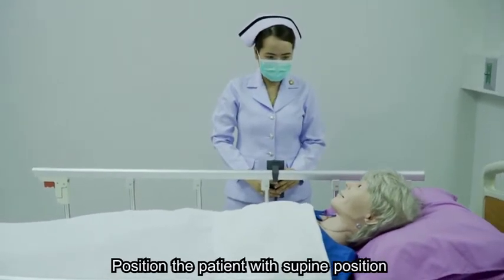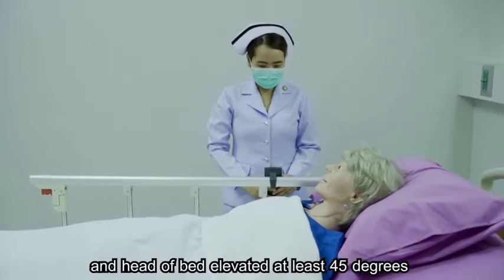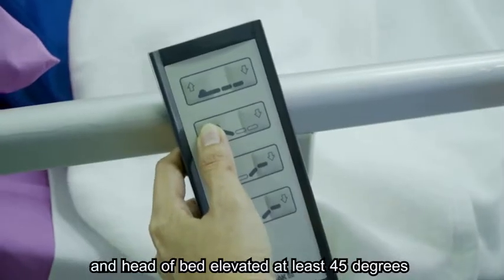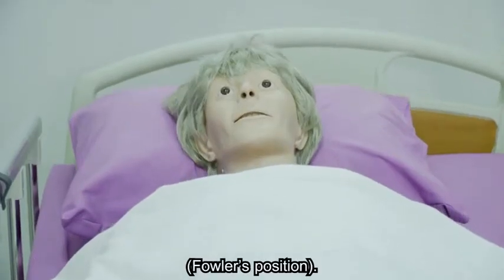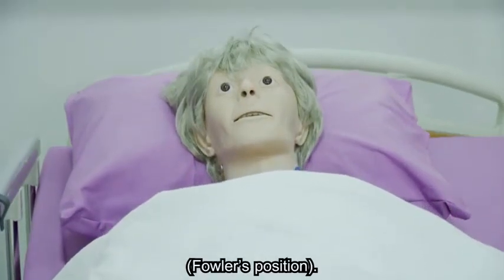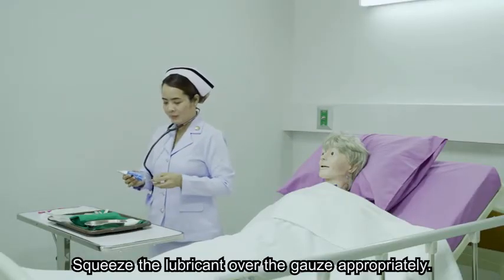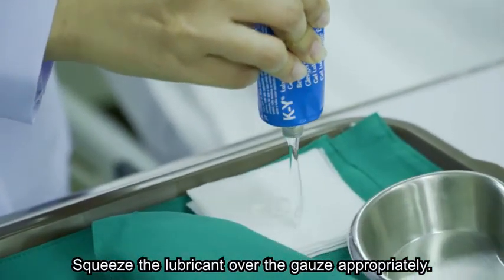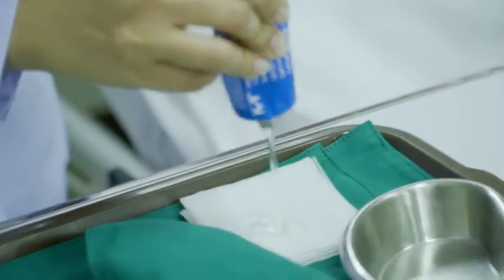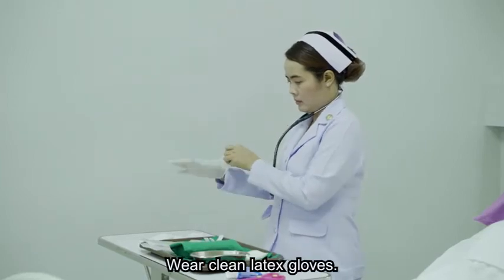7. Position the patient supine with the head of the bed elevated at least 45 degrees, or in Fowler position. 8. Squeeze the lubricant over the gauze appropriately. 9. Wear clean latex gloves.